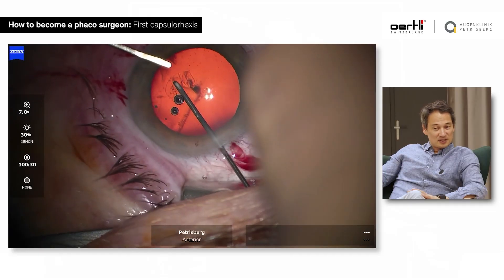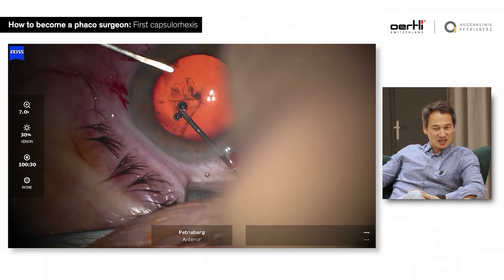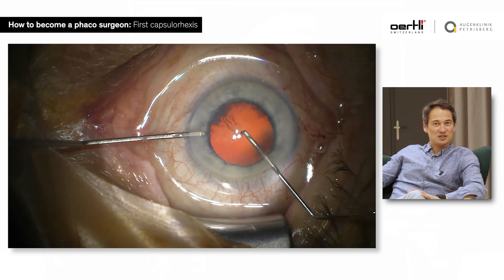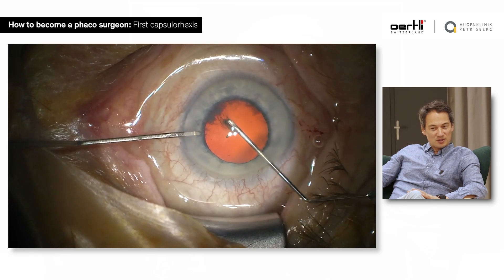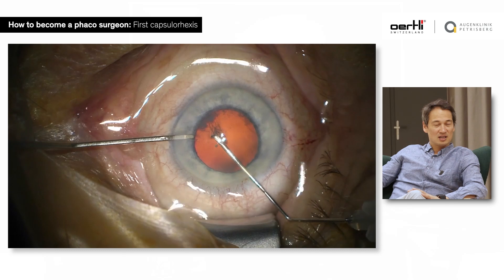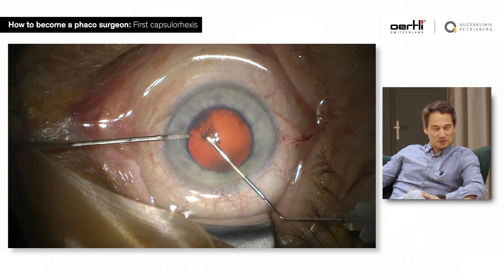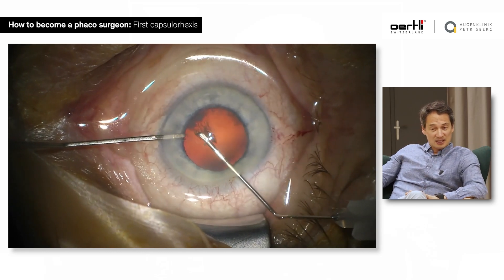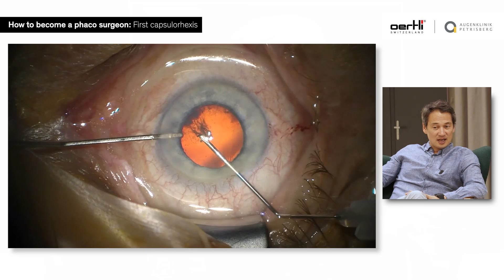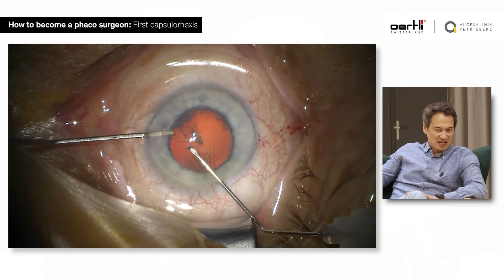Whether you do it with a cystotome or with the forceps, I don't think it really matters. We do it with the cystotome mostly because we have a temporal tunnel incision, and this gives you the opportunity to perform the capsulorrhexis on the right eye and on the left eye with your dominant hand.